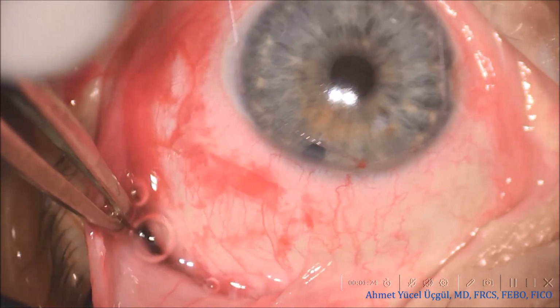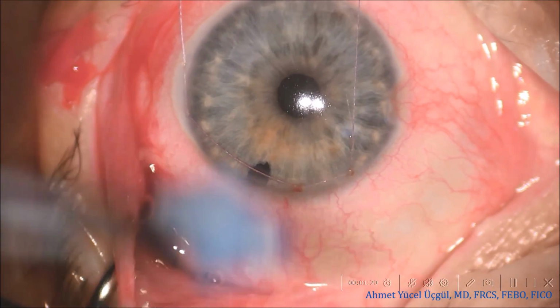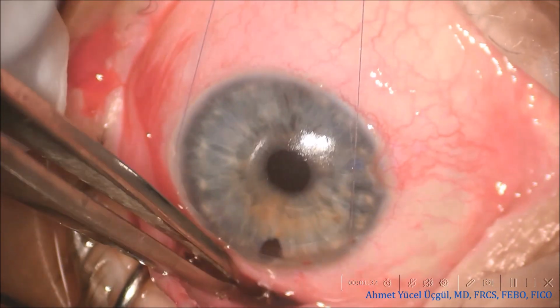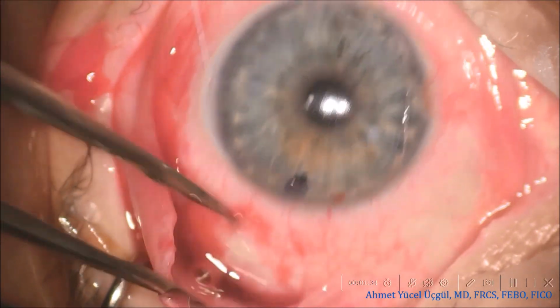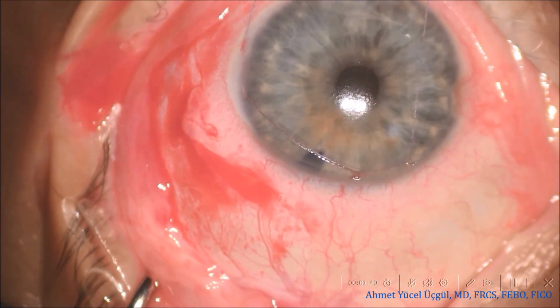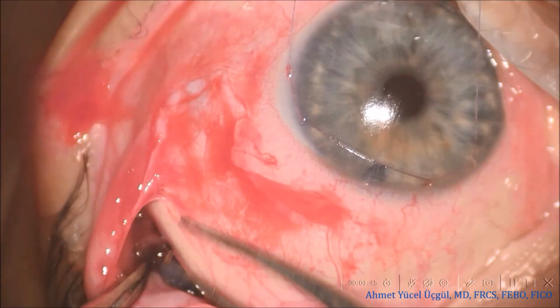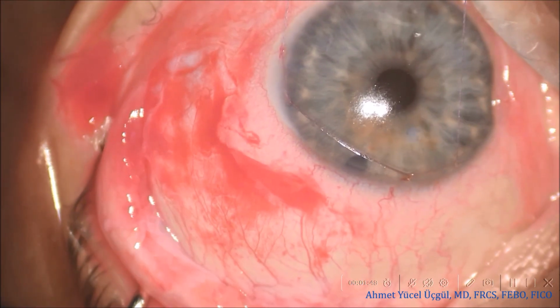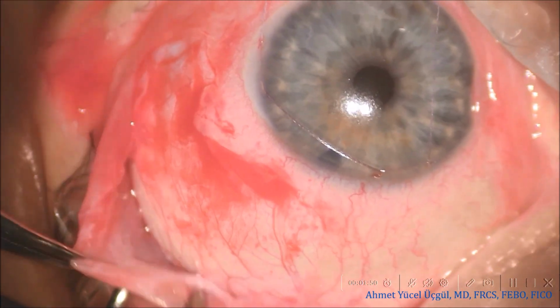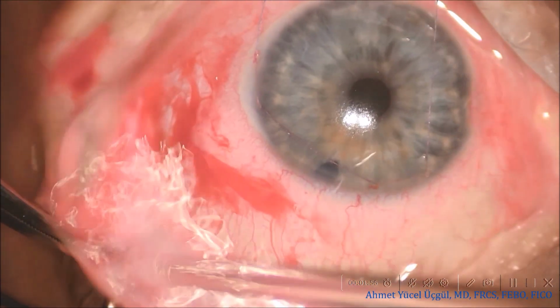Here, standard dose mitomycin C is applied using sponge pieces that have been stained with trypan blue, and the exposure is maintained for 3 minutes. I find trypan blue particularly useful because it makes the sponges much easier to identify during removal and helps prevent them from being missed within the orbital tissues. This is followed by thorough irrigation with at least 20 cubic centimeters of balanced salt solution to clear any remaining MMC from the surgical site.